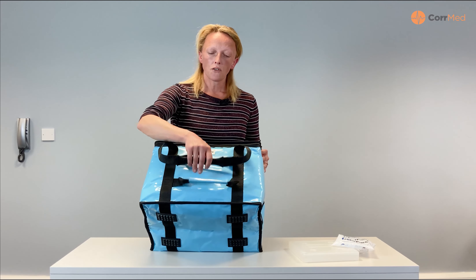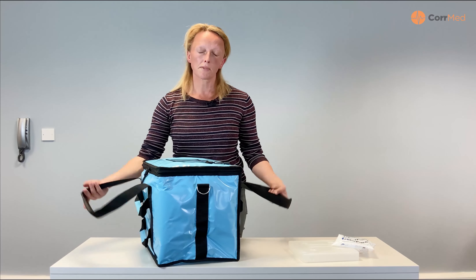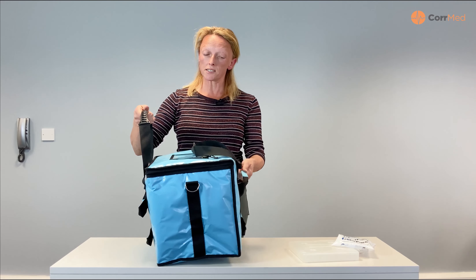This is our 20 litre vaccine carry bag. You can see when it's delivered to you, and for storage it comes in a very, very small box, so it's easy to compress and size.